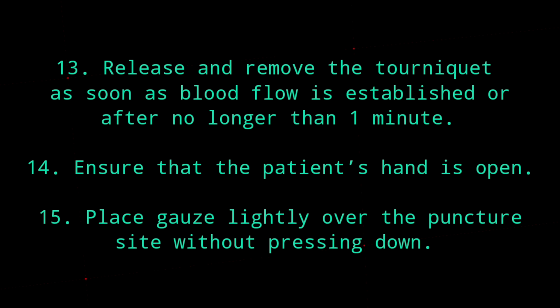Release and remove the tourniquet as soon as blood flow is established or after no longer than 1 minute. Ensure that the patient's hand is open. Place gauze slightly over the puncture site without pressing down.